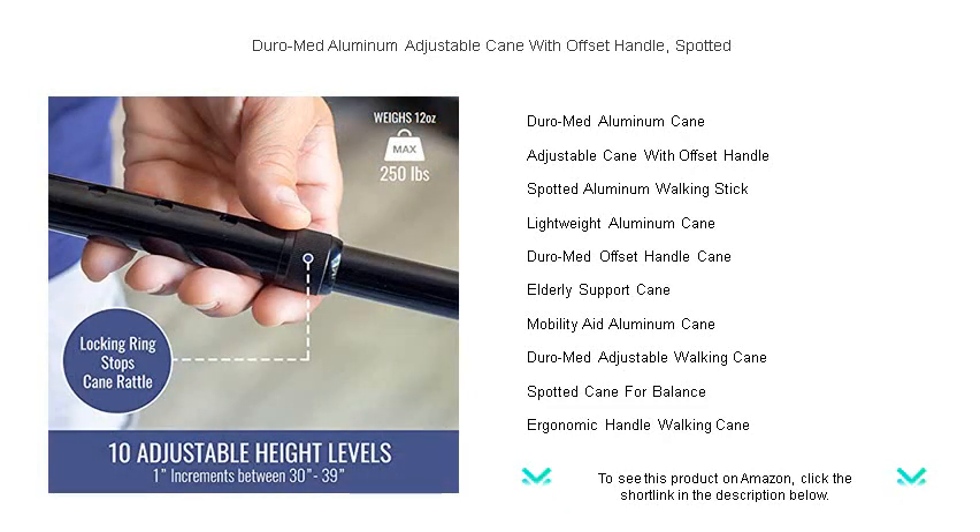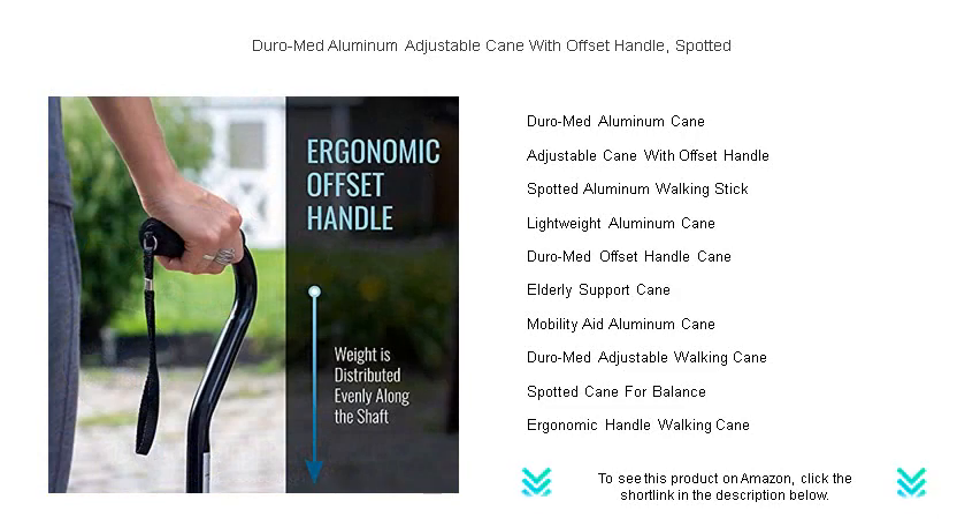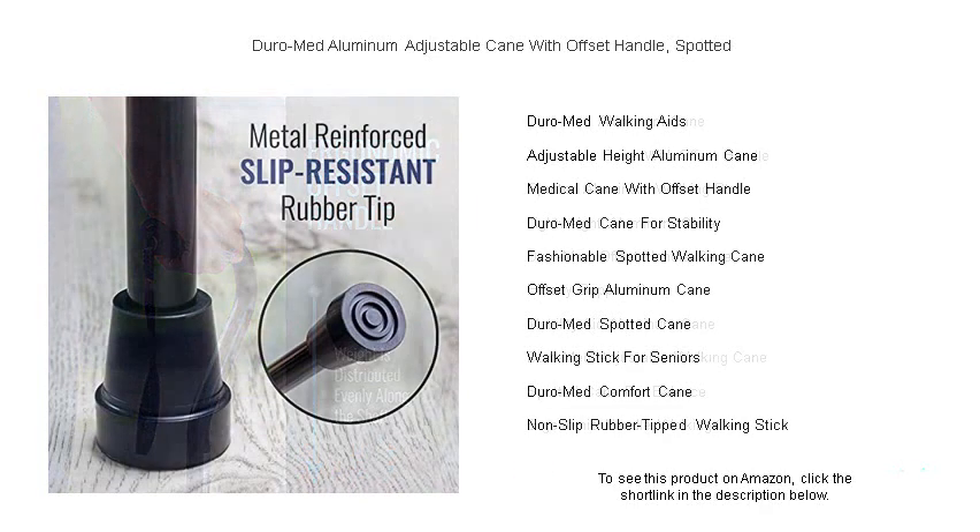The offset handle, ergonomically designed to distribute weight evenly, ensures a comfortable grip, reducing strain on your wrist and providing you with the confidence to move freely. Fully adjustable, it caters to your unique height requirements with a simple push of a button.